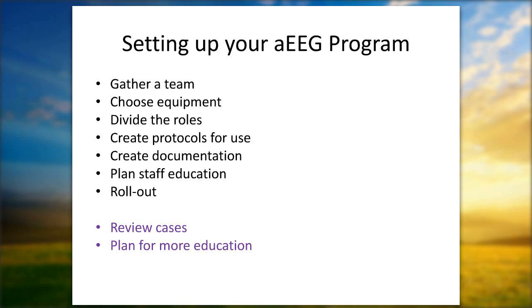So these are the basic steps: gathering your team, choosing your equipment, dividing up the roles, creating protocols for use, figuring out where you're going to document, who's going to document, and when, planning staff education, picking a date for when you're going to start, and just start. Then that periodic review, and then planning for more education in the future.